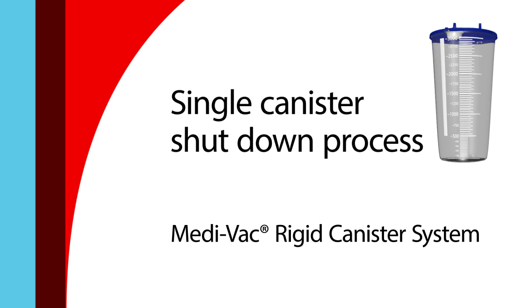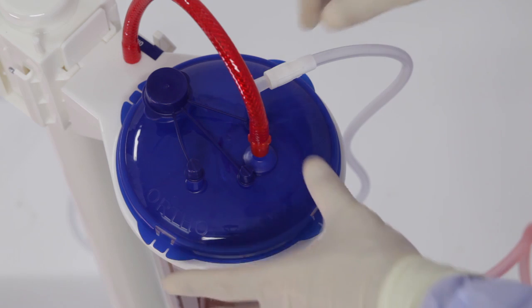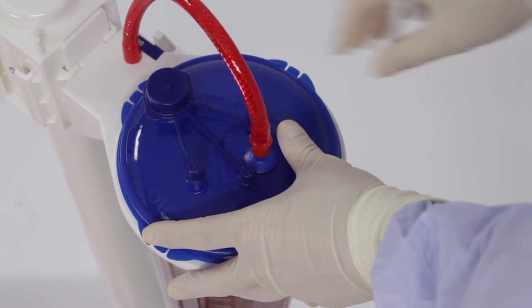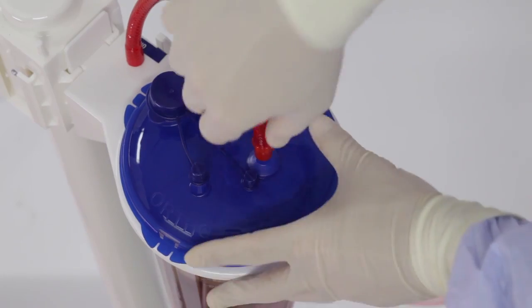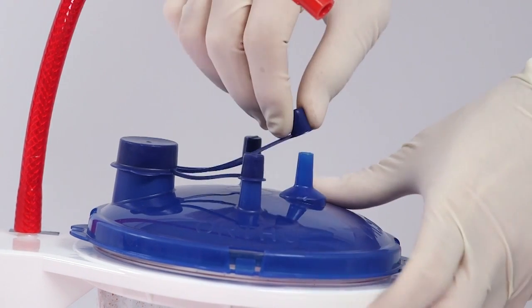While completing the shutdown process, ensure the vacuum suction remains on until the canister is properly sealed. First, disconnect the patient tubing from the patient port and securely cap the port. Next, disconnect the red braided tube from the vacuum port and securely cap the port.